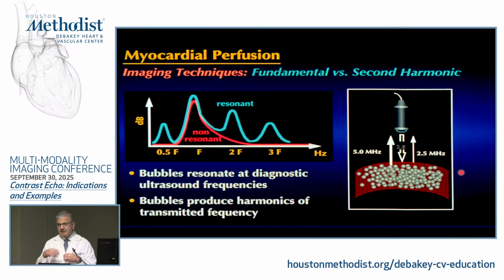You hit a structure, and that structure will reflect back the same ultrasound frequency, the fundamental one, but also once you hit that certain structure, particularly the microbubbles, they will resonate. And they will emit, in addition to the fundamental frequency, a multiple of it. They are very deformable, and they will emit quite a bit of that second frequency. So always less than the fundamental, but if you emphasize it over that of the tissue, you're going to see much more contrast. Again, part of optimization.